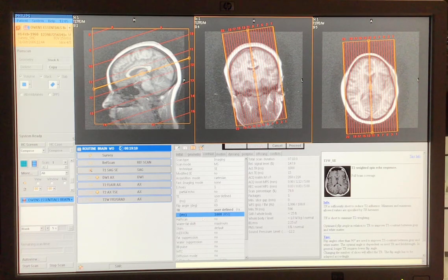Yeah, you should. Have you guys been given any ranges at all yet for TR and TE? Yeah, we went over some ranges, but they didn't tell us that we needed to know it, or rather, we didn't memorize it. I have it written down from the summer. I didn't memorize it.